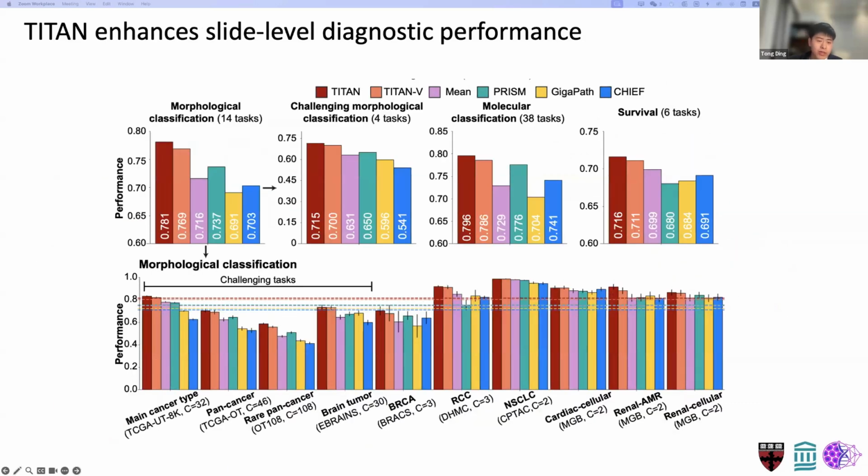Yeah, and next we evaluate Titan under linear probing on this diverse set of tasks, including morphological classification, molecular classification, and survival.